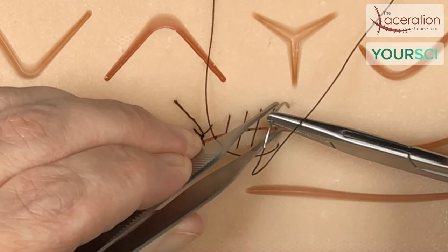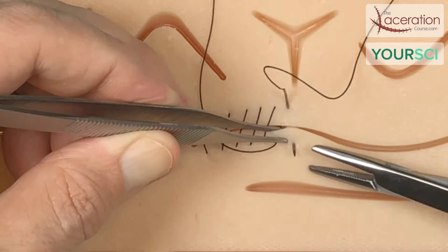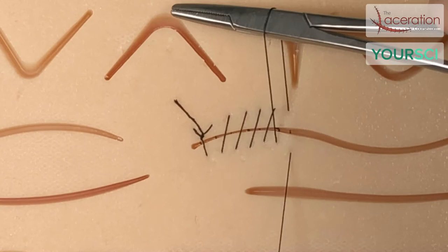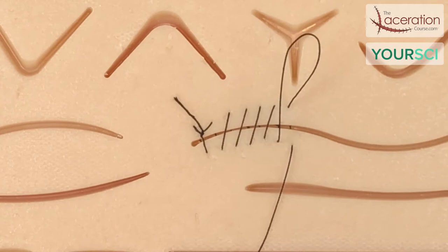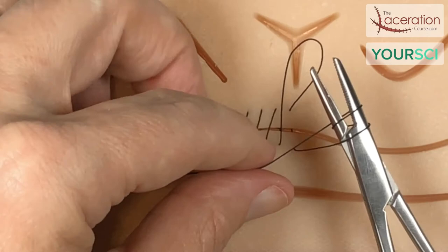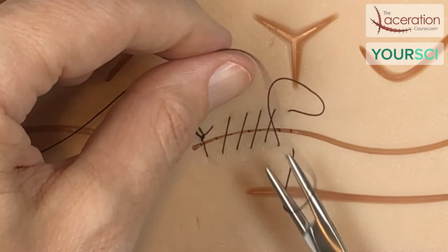This is going to be my last one, and then I'm going to show you a couple things. I'm going to enter the skin at 90 degrees, come out across, and try to get as perpendicular as I can. This time I'm going to leave this last loop loose. This is what is going to serve as my tail, as if I were doing just a simple instrument tie. I'm going to wrap around twice and grab the apex — the top of that loop — so that when I pull it down and across, it lays down flat.